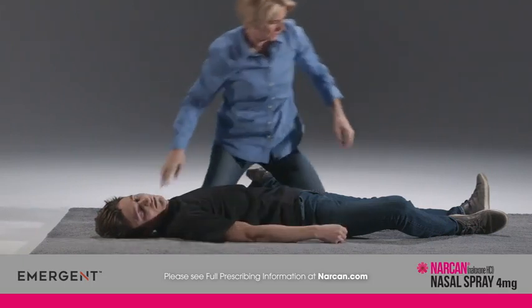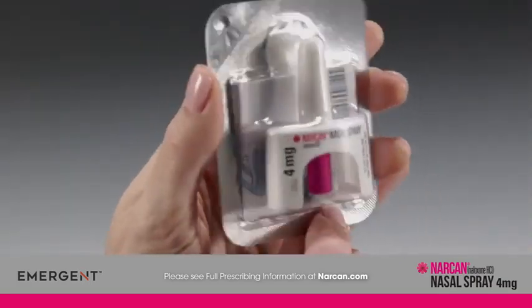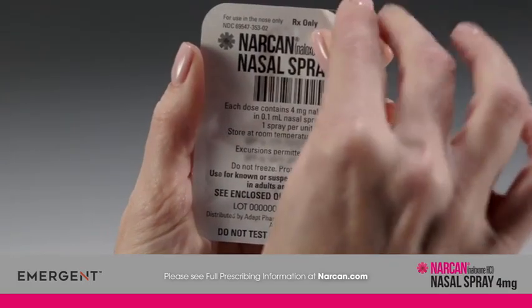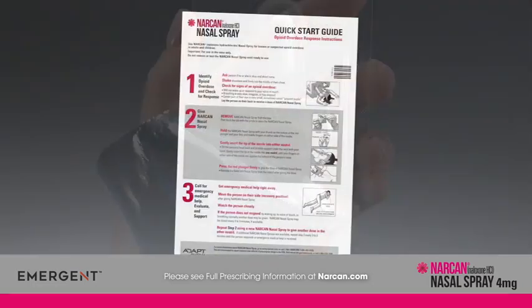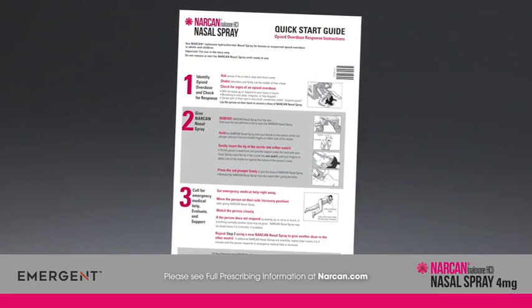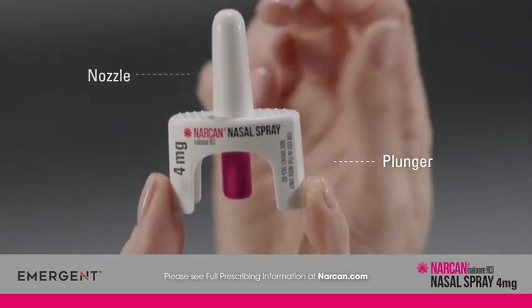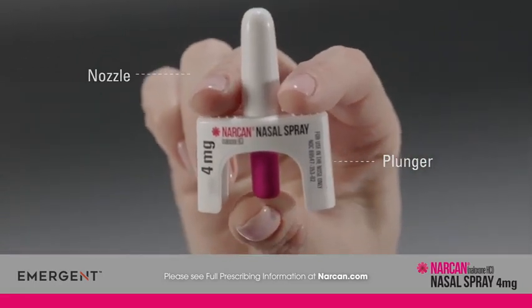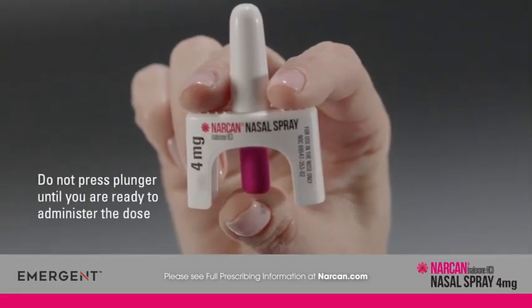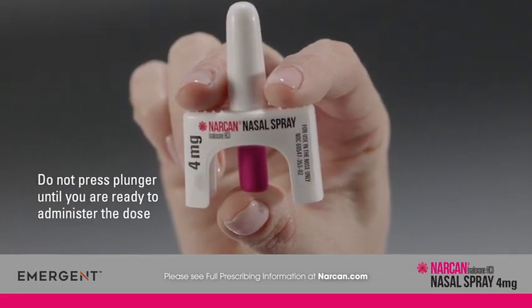Lay the person on their back to receive a dose of Narcan nasal spray. Remove Narcan nasal spray from the box and peel back the tab with the circle to open the blister pack. Remove and review the printed quick start guide inside the package. Hold the Narcan nasal spray with your thumb on the bottom of the plunger and your first and middle fingers on either side of the nozzle. Do not press the plunger to test or prime the device — if you do, you will waste all or part of the dose of medication.